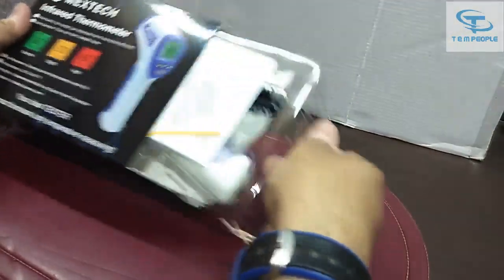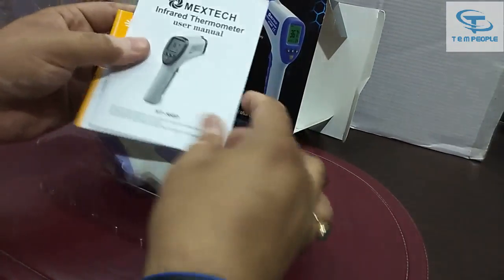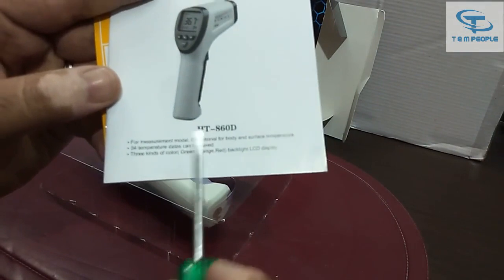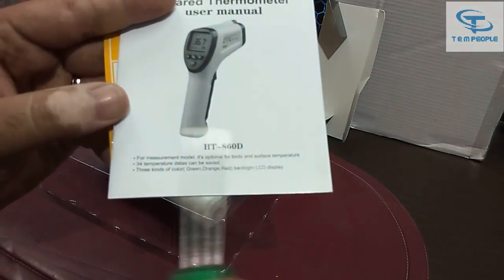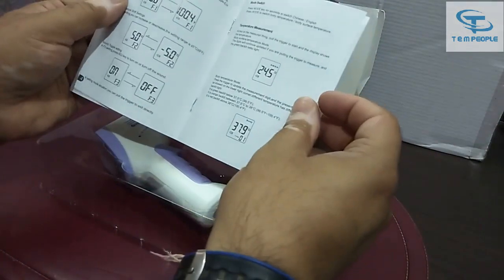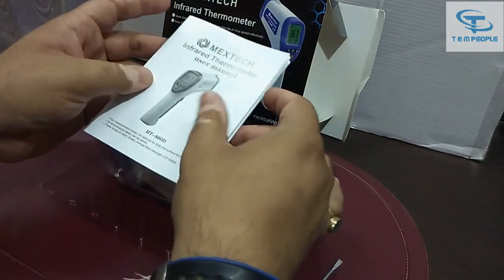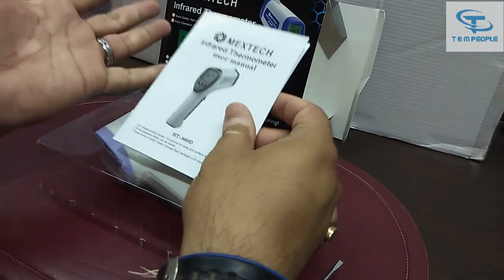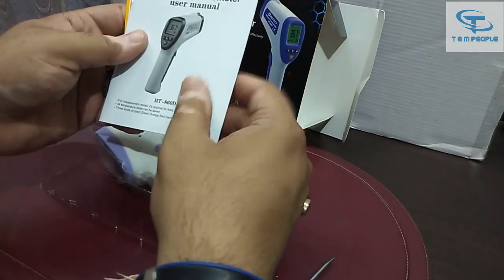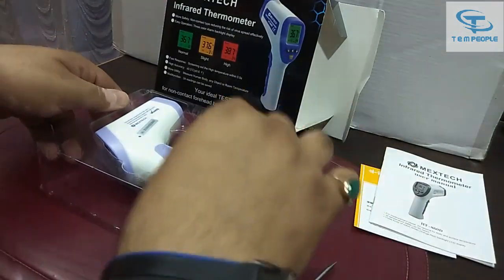Now opening the box — you can see there are some certificates provided, as well as a manual for the instrument. The model number of this meter is HT 860 D. The manual has all the specifications. It can measure both body temperature and surface temperature — you just have to change the mode.